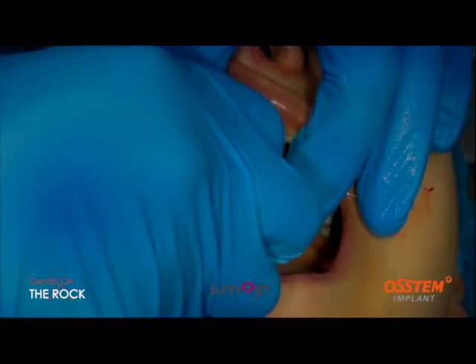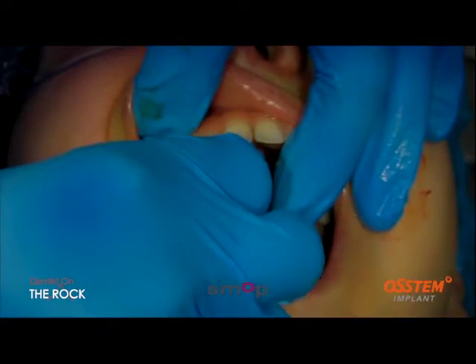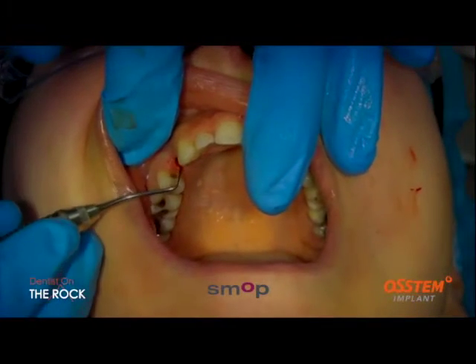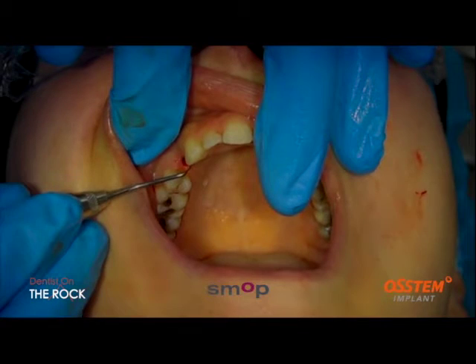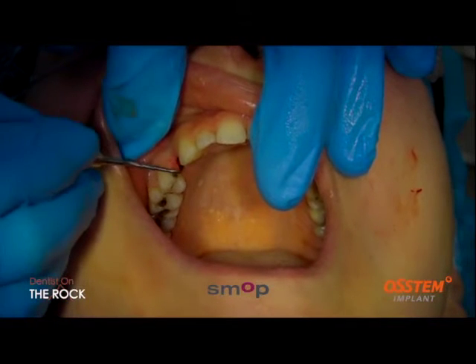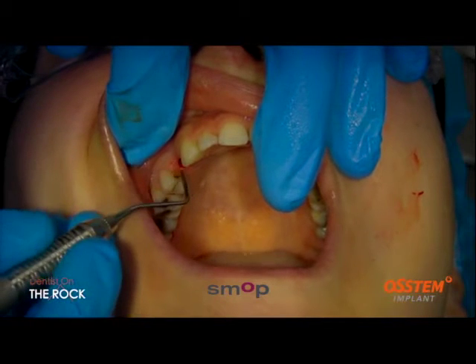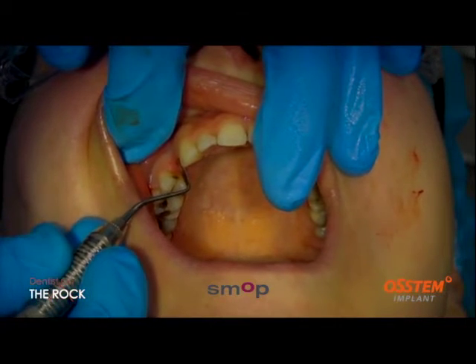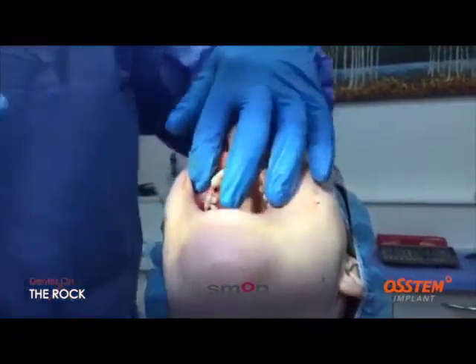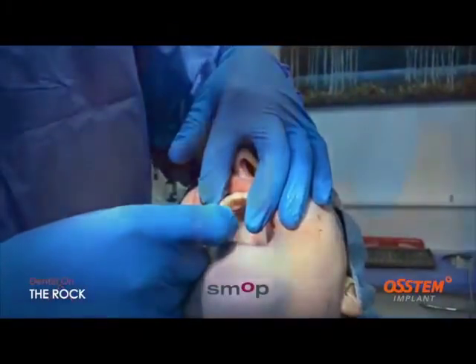In fact, maybe it's over because what I didn't do, just check the bone level. Like I said before on the stickler, I can feel the edge of that bony plate there, and I can feel that the implant is just ever so slightly subcrestal, exactly where I planned it in the guide. The same buccally, I can feel the buccal plate just under this little soft tissue, and then a little bit deeper, the implant. So I know then that I've got the amount of bone in all directions that I planned. Then replace the cover screw.